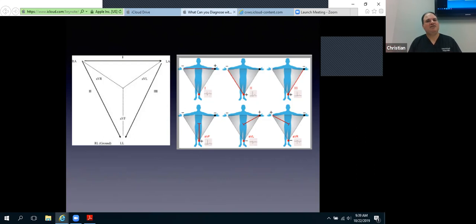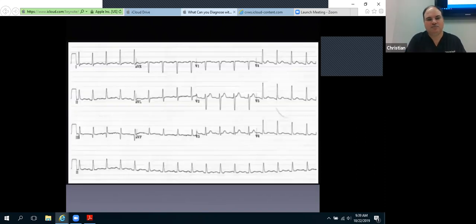It's not the exact opposite because they have different polarities that are influenced by how they're done. One's a dual negative and the other one's a single negative, and it gives you a different perspective. There's a reason why it does that. So the angles at which this is occurring are different. I'm going to explain that next. So here's a regular EKG.